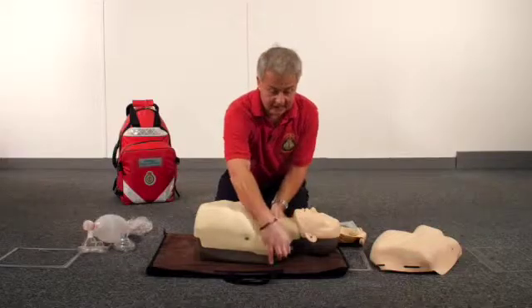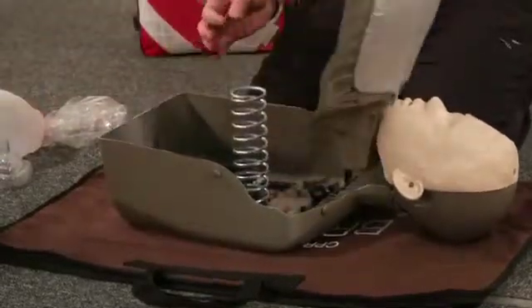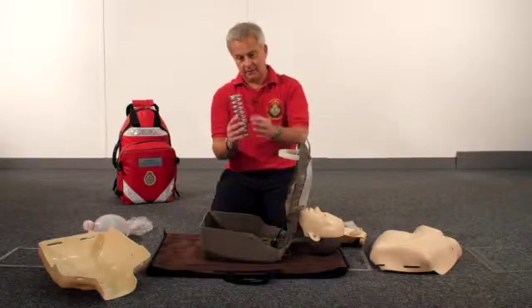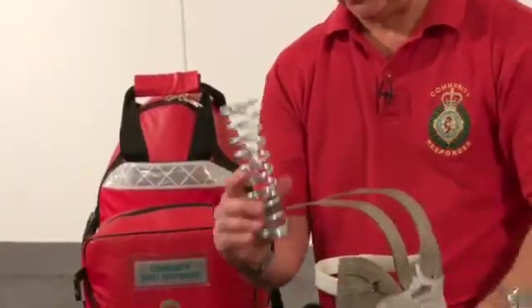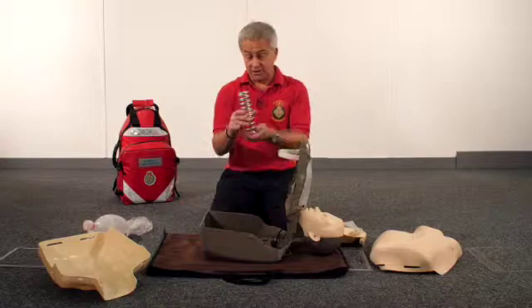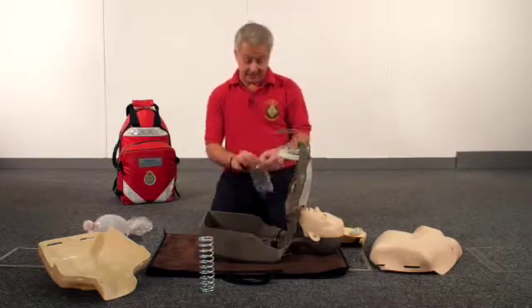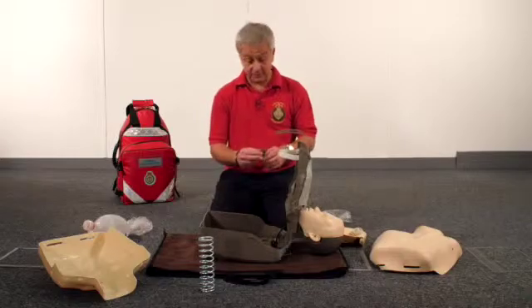You then remove the adult chest skin, open the internal chest piece to expose the spring, and pull the adult spring out. This spring requires you to apply 40 kilograms of elastic force to push the chest down five to six centimetres. Published studies suggest that is the correct force needed for the average adult person. You now need to replace that spring for one which is more representative of a child or a young boy of 10 to 12 years old.